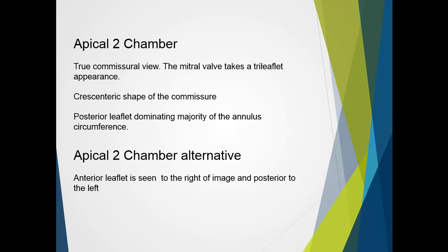There are two apical two-chamber views. There is the true commissure view, where both the posteromedial and anterolateral papillary muscles are seen. The mitral valve takes on a tri-leaflet appearance. We can observe the medial portion of the posterior leaflet, then the mid portion of the anterior leaflet, and then the lateral portion of the posterior leaflet again. This presentation is due to the crescentic shape of the commissure and the posterior leaflet dominating the majority of the annular circumference.